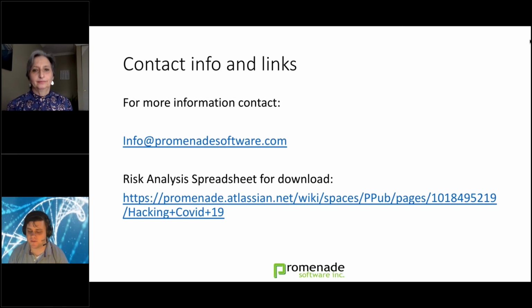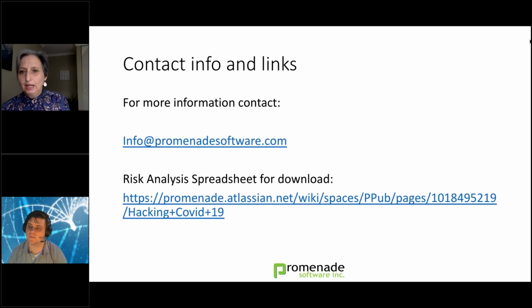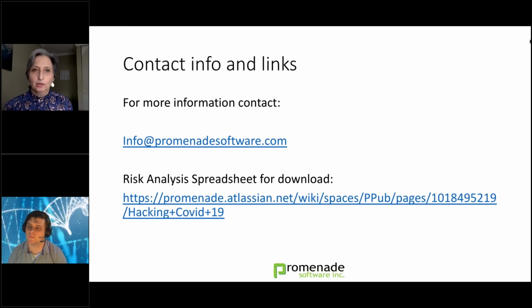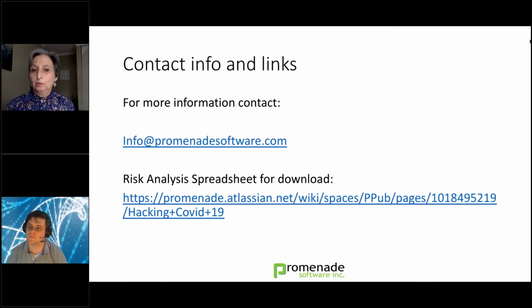Do you think the FDA has relaxed any of their requirements when it comes to submitting this kind of documentation that you know of? The FDA has changed the requirements only for existing devices. If you need to make a change on an existing design that's already been cleared, maybe because your supply chain is impacted and you're putting in different tubing or something, they will let that go without new submission material for COVID.